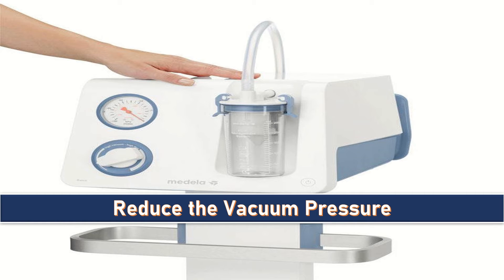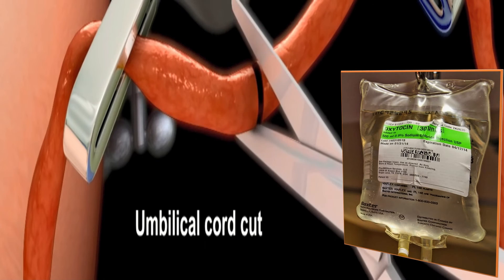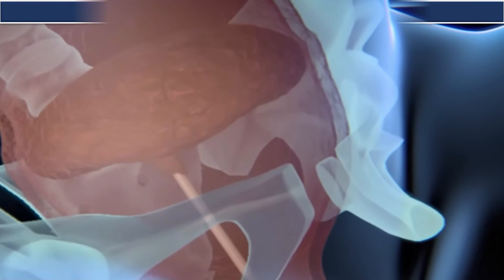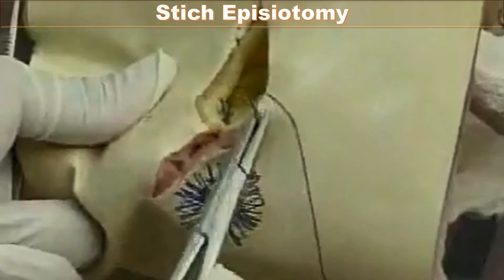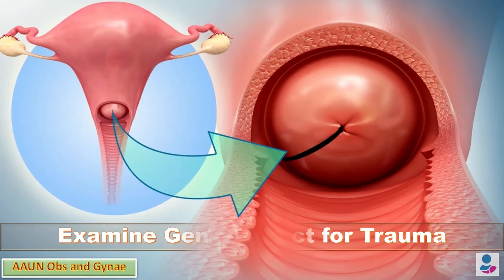As soon as the head is delivered, I will reduce the vacuum pressure and ease the cup off the scalp, then complete the delivery in the normal way. I will give oxytocin, cut the cord between the clamps, and hand the baby to the pediatrician. Then I will deliver the placenta and check for its completeness and membranes.